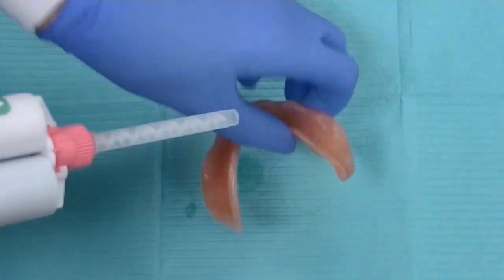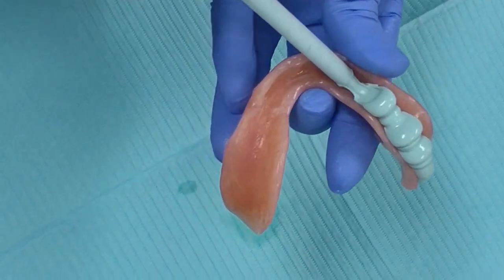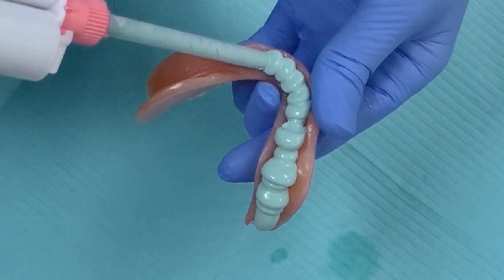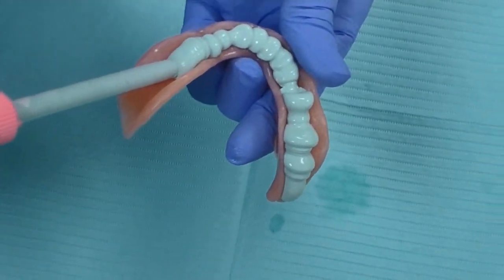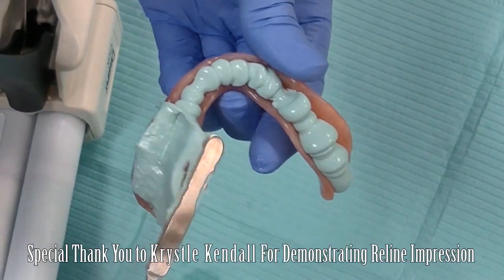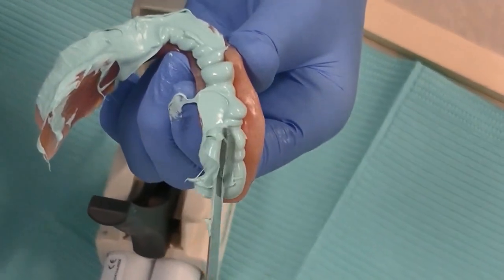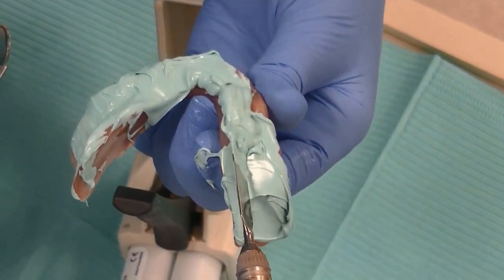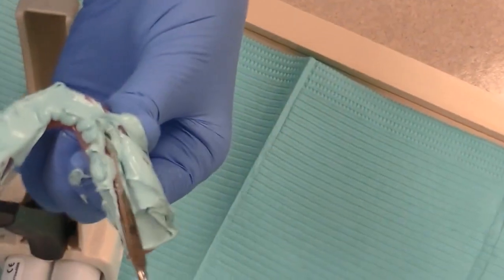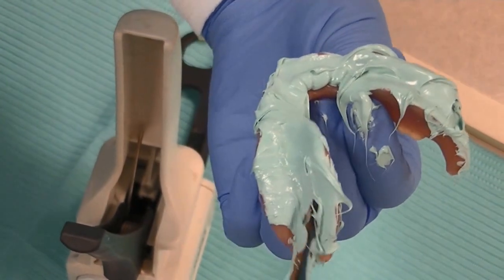For the first step, we take our radio-opaque PVS impression material and, without any adhesive, primer, bonding agent, or anything in the patient's denture — just dry it out — we inject the radio-opaque PVS material onto the intaglio surface of the patient's denture. We then take a spatula, very similar to an everyday clinical reline impression, and roll our borders. It's important to get nice rolled borders with this technique, as we rely upon them to provide our radiographic markers.